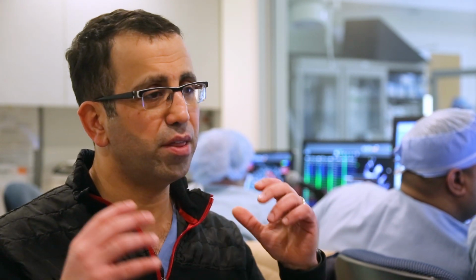At the peak dose of isoprel infusion, we pace the heart from the coronary sinus into atrial fibrillation and then shock the patient back to normal rhythm on isoprel. The idea behind this is that you reduce the threshold for fibrillation, and AF can be more easily induced with medication.